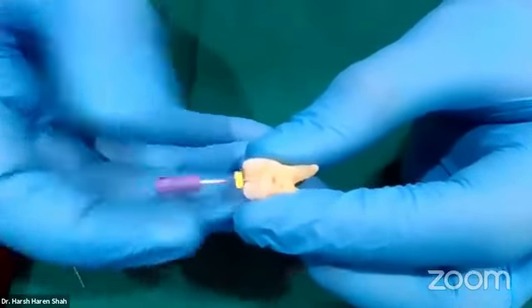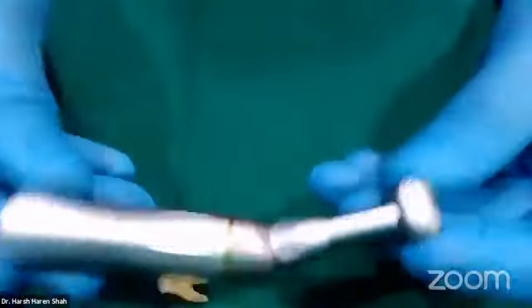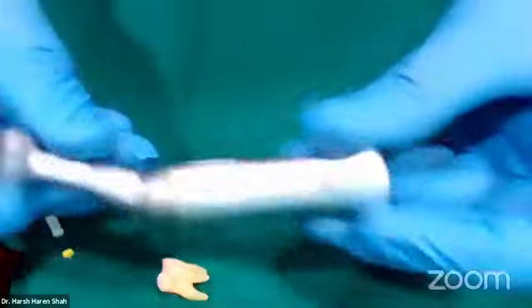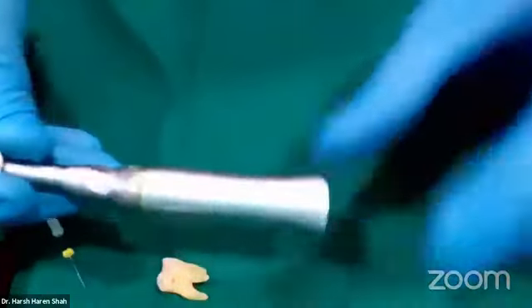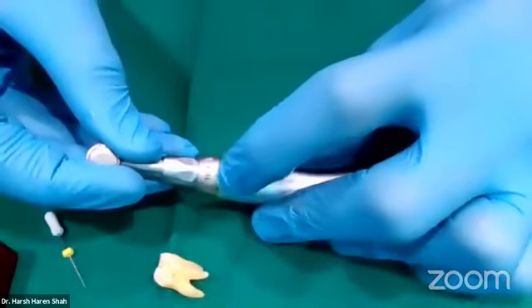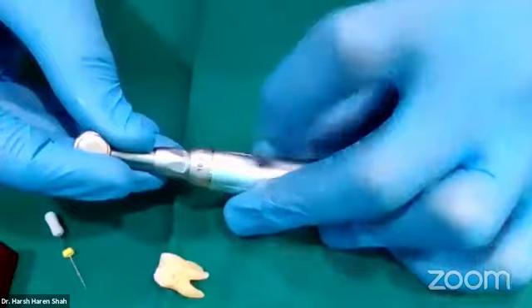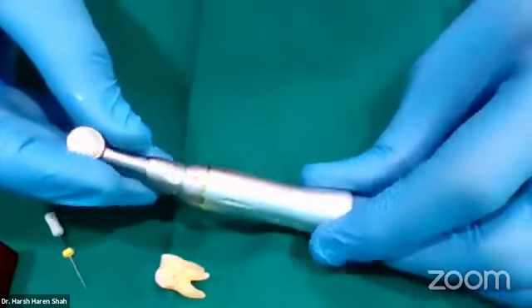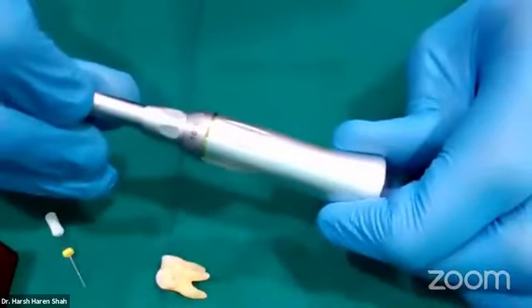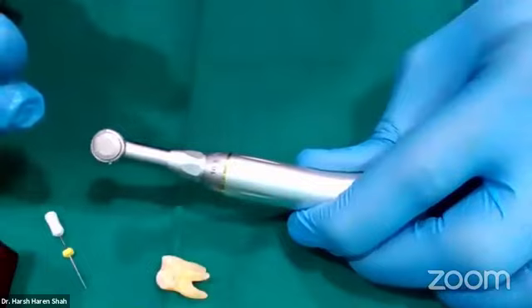Now, if you don't want to do this manually, the second technique that we had discussed was with the use of these kind of reciprocating handpieces. A few details that I would like to share here. The handpiece that I'm using right now is a K400. This has a gear reduction of 10:1. In case you have any doubts about what this 10:1 means, you can put it in the comments below and I'll try to answer this later. So this has a gear reduction of 10:1, so it will basically slow down the speed of my micromotor 10 times.